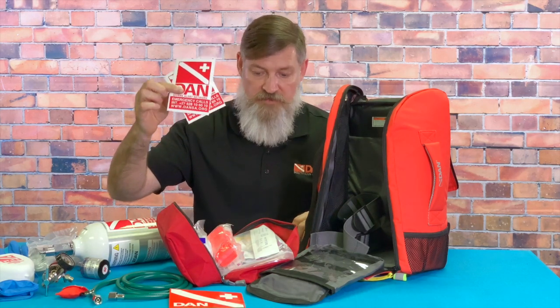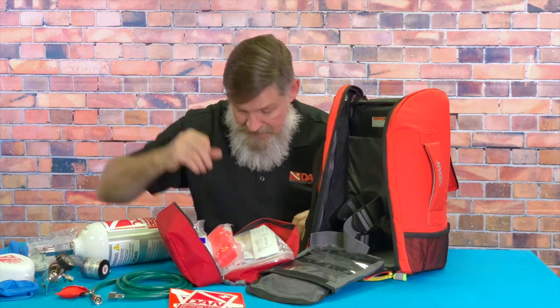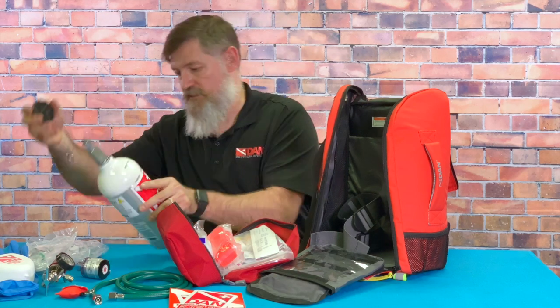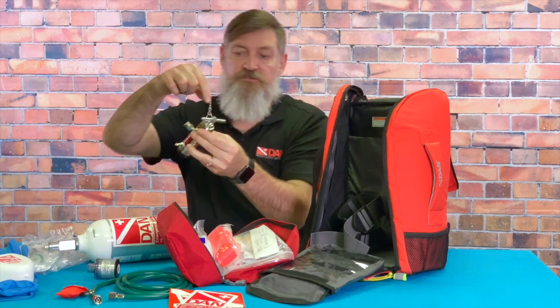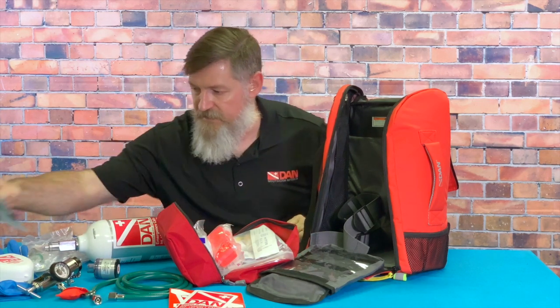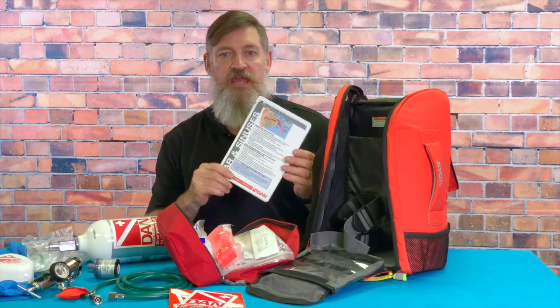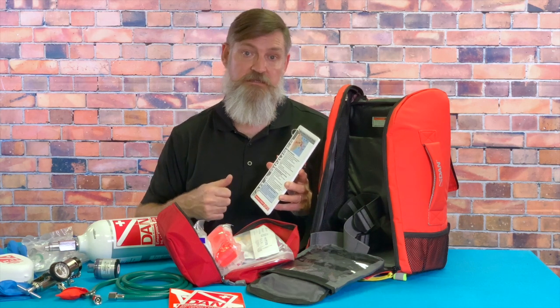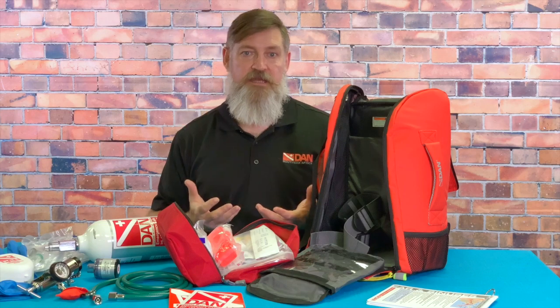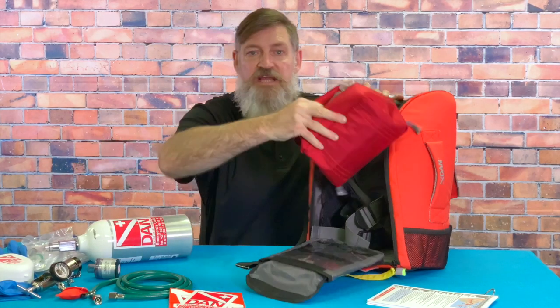You get a range of stickers — if you have a boat or a box nearby you can put these on to indicate that you've got oxygen — and DAN stickers with hotline numbers. There's also a hand wheel wrench to fit on top of the cylinder valve to open and close it. These are the demand valve and regulator paperwork, and these DAN first aid course slates cover first aid, oxygen administration, neurological assessments, and hazardous marine life. They're waterproof — a great addition.